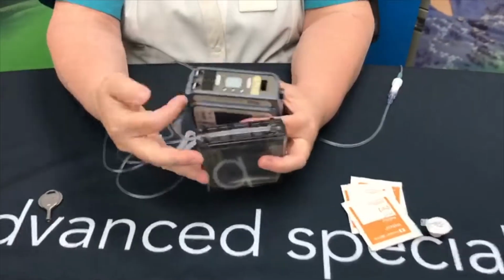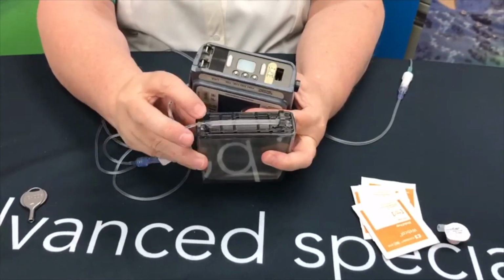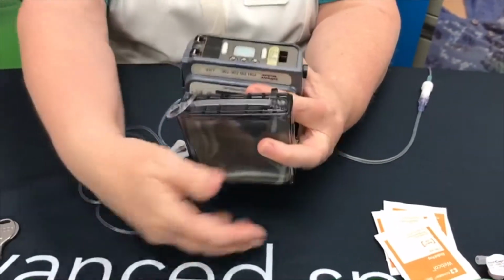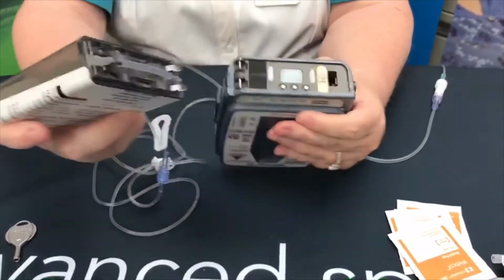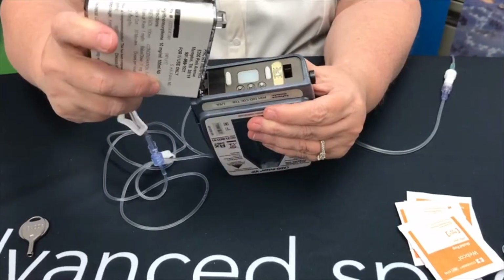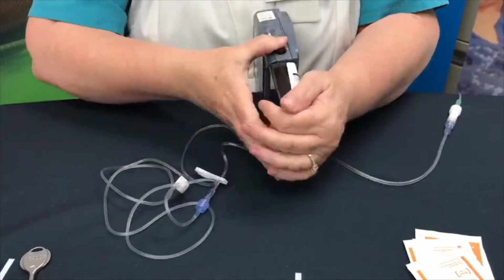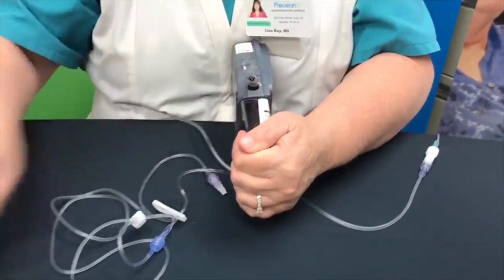On the bottom of the pain cartridge, there are 2 plastic feet, and on the bottom of our pump, there are 2 metal feet. We're going to place those plastic feet underneath the metal feet, and then we're going to tightly hold the new cartridge against the pump.